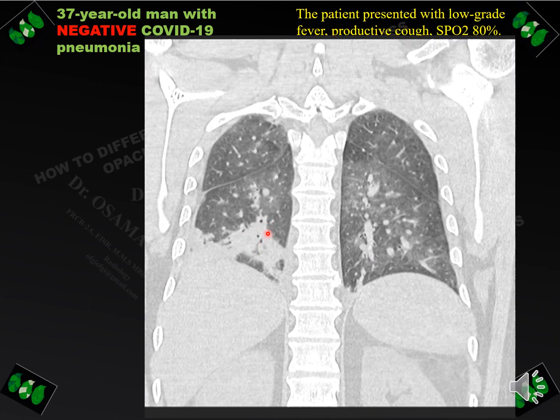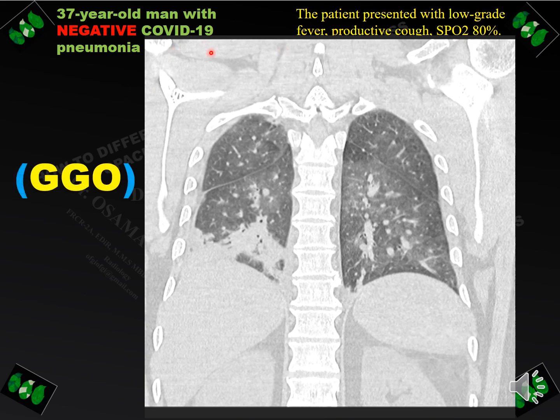In this patient with abnormal consolidation — shown by obscuring of the blood vessels and air bronchograms — there are also abnormal high attenuation areas and low attenuation areas through both lung fields. The first question is: which area is abnormal? Looking at the blood vessels, if the blood vessels are equal in size, ground glass opacity is diagnosed. This patient tested negative for COVID-19 pneumonia and has both consolidation and ground glass opacity.